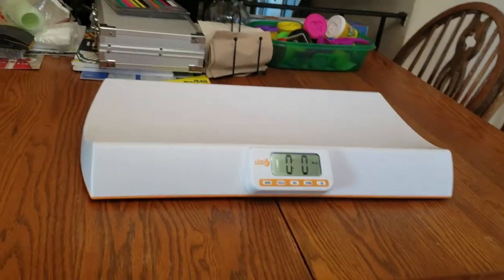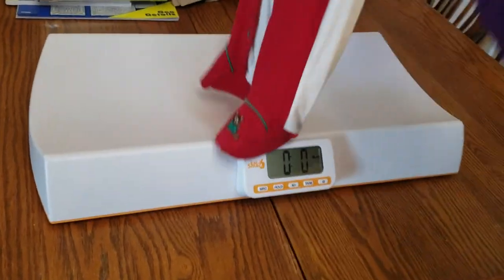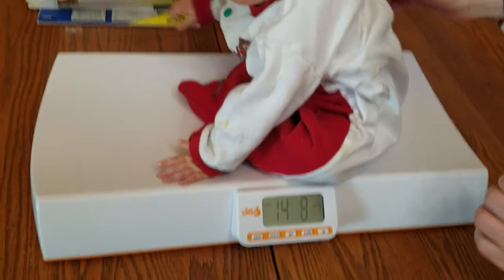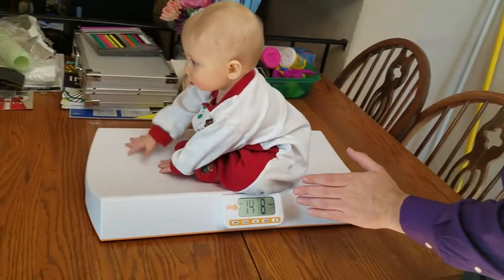Hey guys, this is the new product review — this is the awesome baby scale that I've been talking to you guys about. We've tried to take this video a few times, so let's see if miss Lils is gonna hold true. There we go — there's a little bit of a glare, there we go.